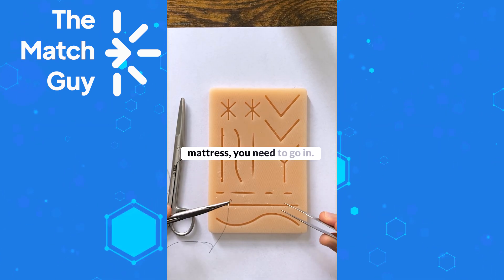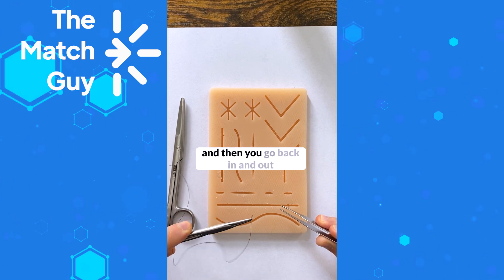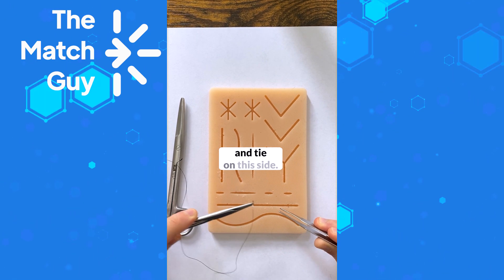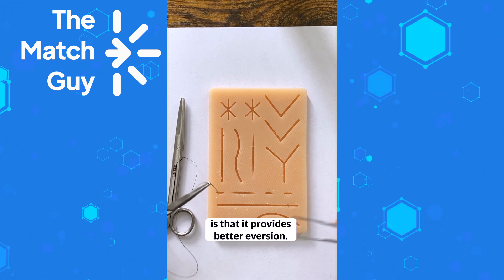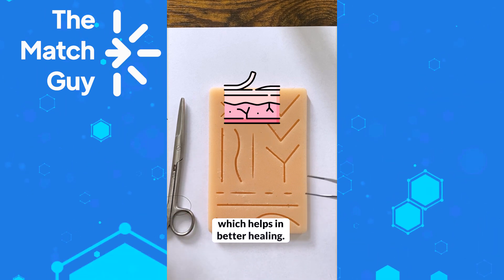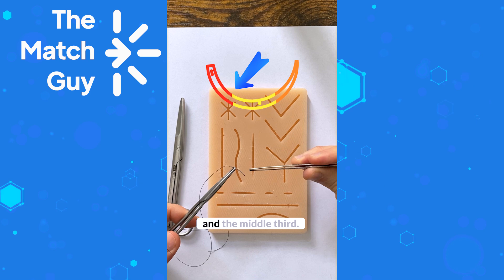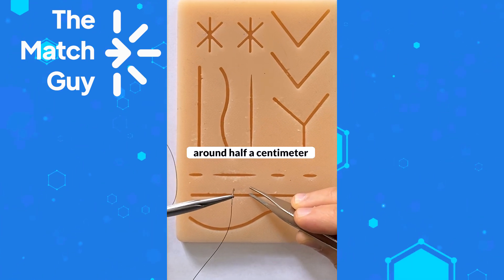To do a horizontal mattress, you go in then come out like a simple suture, then you go back in and out and tie on this side. The benefit of the horizontal mattress is that it provides better eversion — the edges of the skin come out more, which helps with better healing. Start by loading the needle between the upper and the middle third, going at a 90 degree angle around half a centimeter from the edge of the wound.